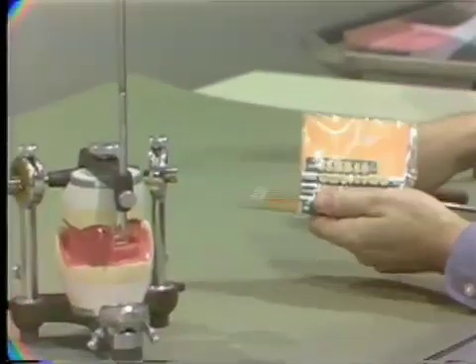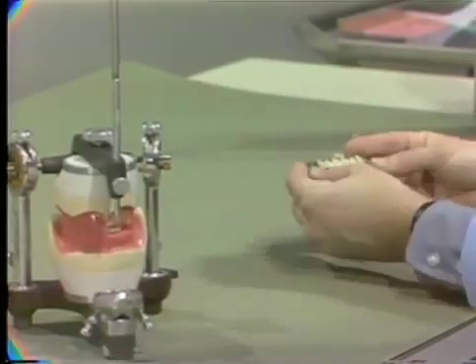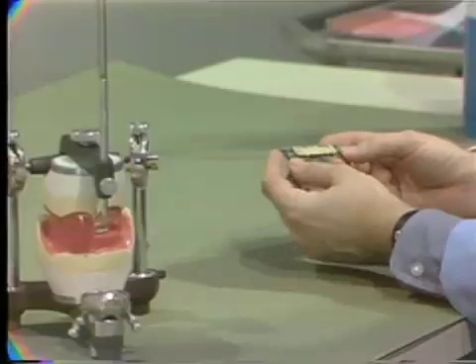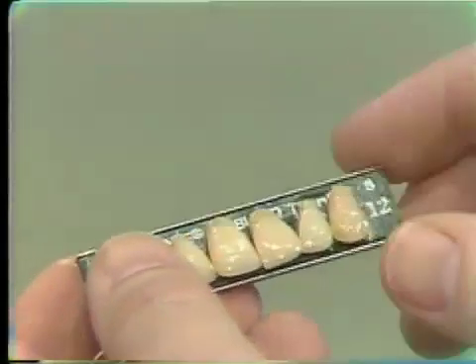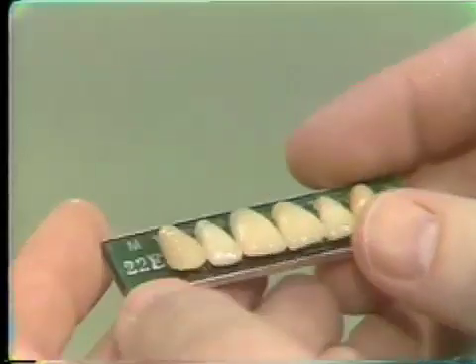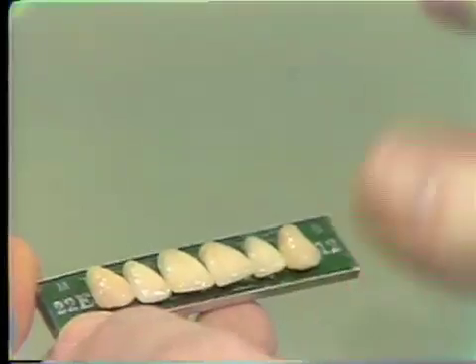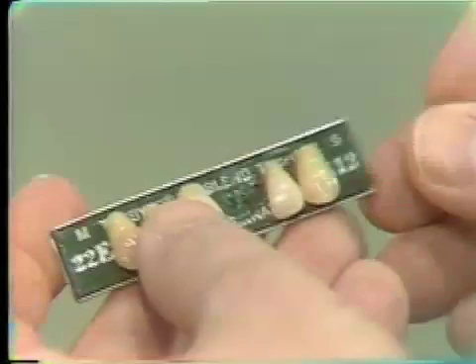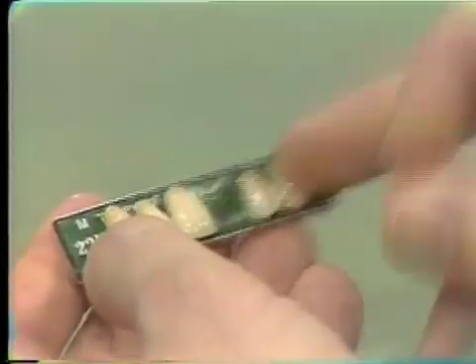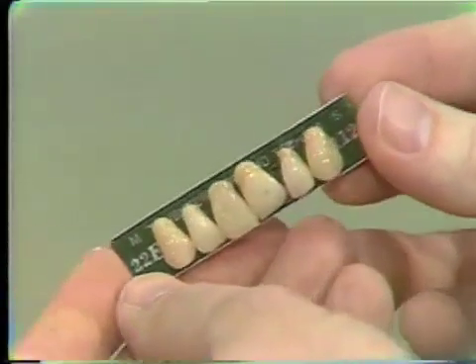You all have purchased a package of the teeth, and this time we're only interested, of course, in the anterior teeth. They come on a card with wax in it, and I would advise that you keep this card because we are going to make 2 setups. And when our teeth are removed or they're sitting on a bench for any reason, as you adjust them, make minor changes and so forth, it's always a good idea to place them back on this waxed card. Okay, so don't throw these away. This is just a plea to keep the cards so when you change teeth, you can keep them in order and so forth.